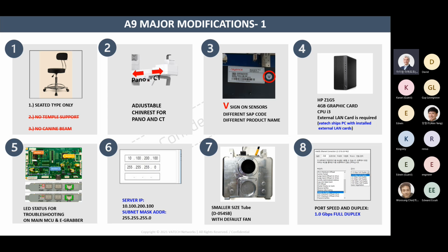And all the sensors have a V sign on them. They have separate SAP codes and they have separate product names, but they look like other sensors. So in order to not mix them, we put this V sign on them, right? And the PC, if you don't get a PC from VATECH, then you have to know that they are installed with external LAN cards.